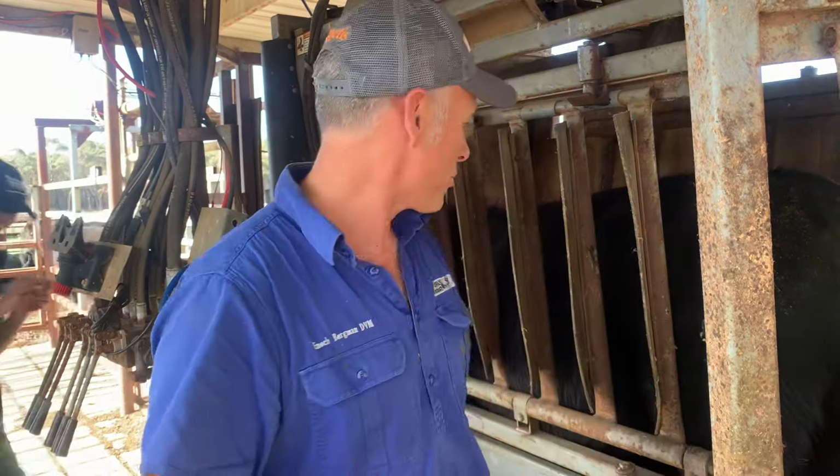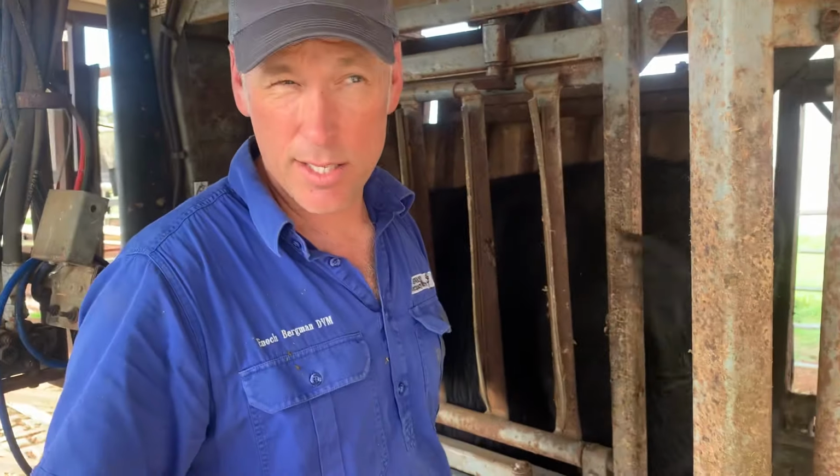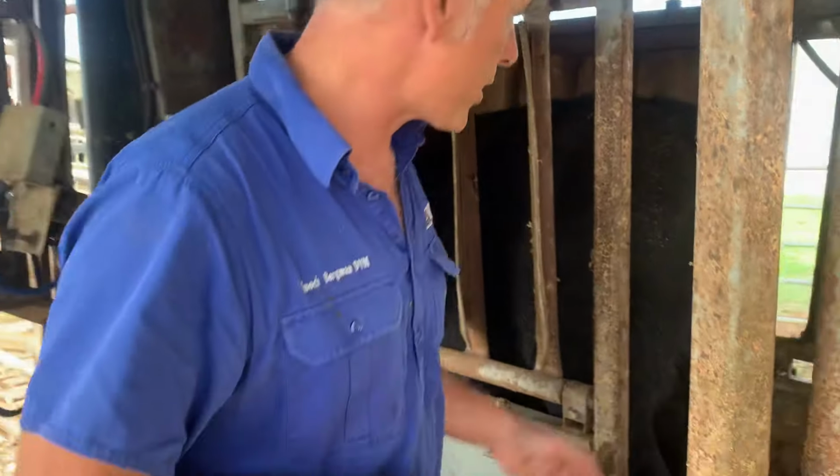Today we're semen testing bulls. This is the last one of John's that John raised. We've tested 29 today for John. First thing you want to do is measure his nuts and look at his hocks. So if you come in here, you can see. Perfect. He's in a silencer crush, so he's less likely to kick us.